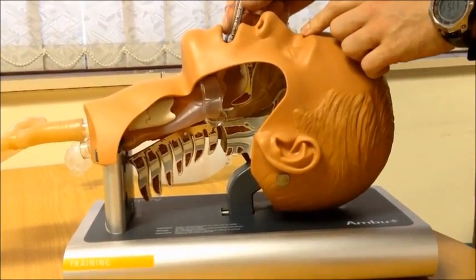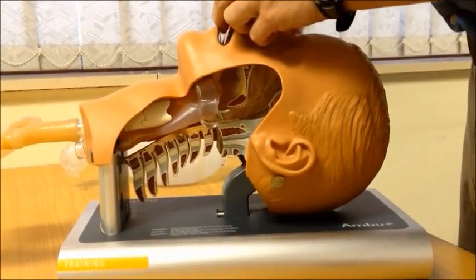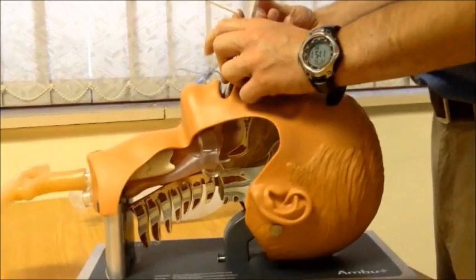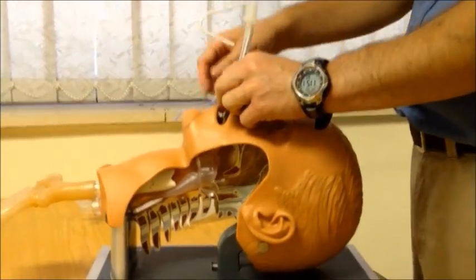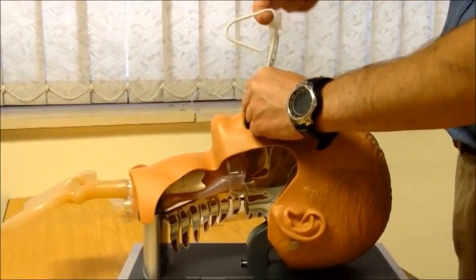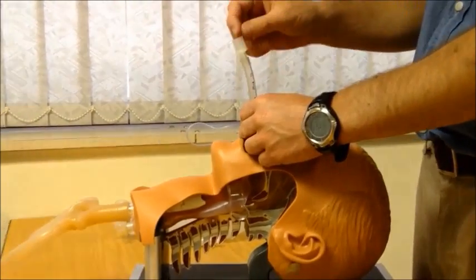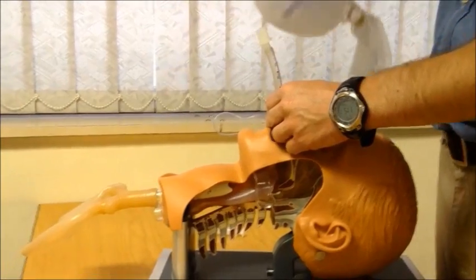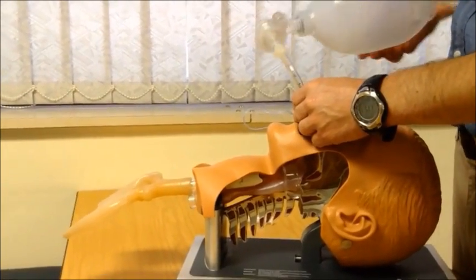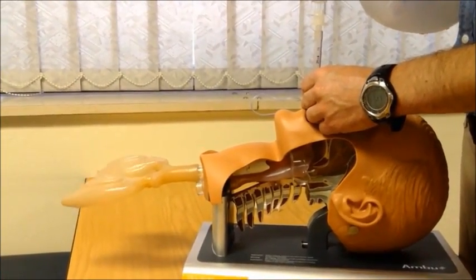Note the depth of insertion, in this case 22 cm at the teeth, and inflate your cuff. Remove and discard the syringe. Maintain secure grip of your ET tube and take out your stylet. Connect your CO2 detector device and after that your bag mask device and confirm correct placement and ventilation.